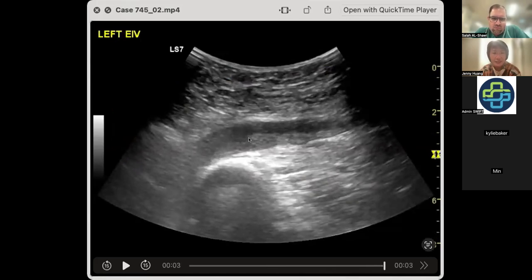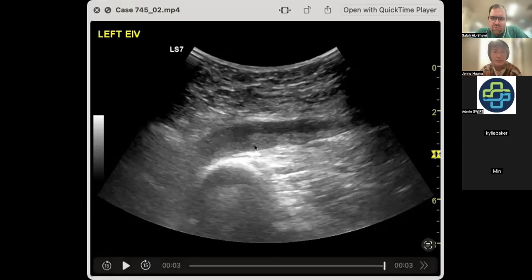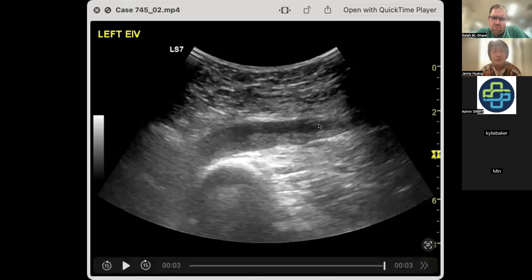In some ways, when you're going to put a cannula in, you put a tourniquet on, and I always leave the tourniquets on for a nice long time to get the veins nice and full. Sometimes they do look full of grey stuff, but as soon as you compress them, it moves on, because the blood's all sitting there, probably getting a bit sludgy, and you've got all that spontaneous echo contrast. All of this is just really slow blood flow.